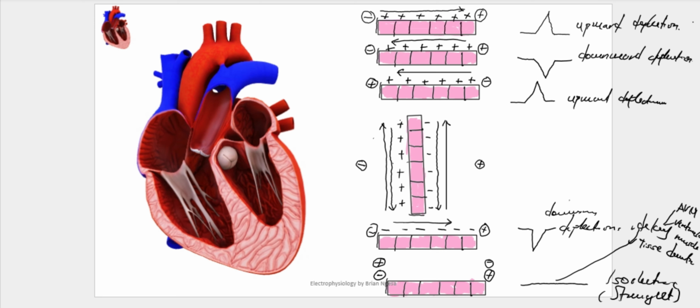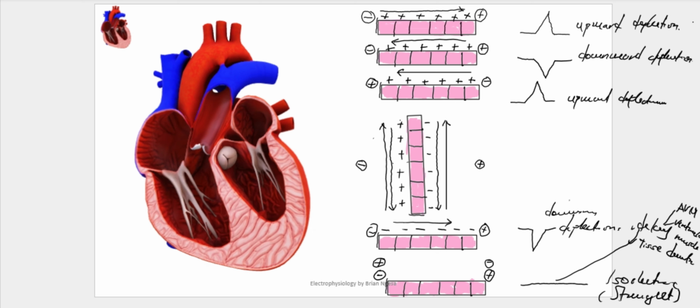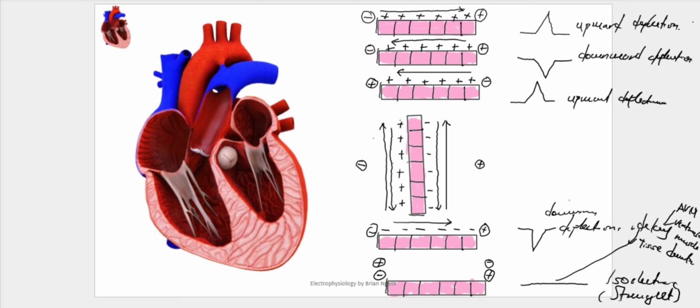So all these 4 circumstances are likely to give us a somewhat similar scenario. This is because these are aligned in a perpendicular manner to the electrical field created by the electrode, so this is the normal behavior. For example, let's choose one and see what happens. Say the positive charges are moving downward.